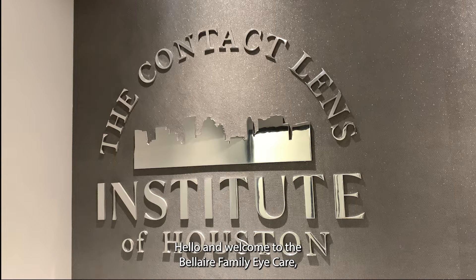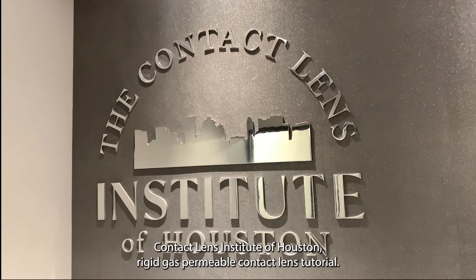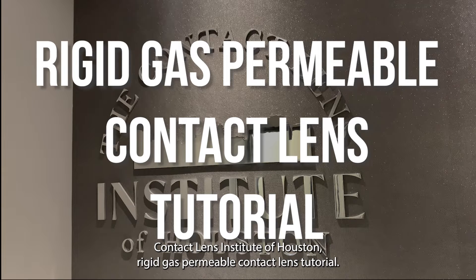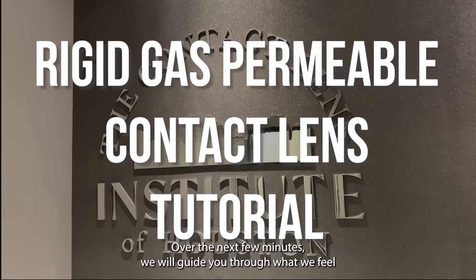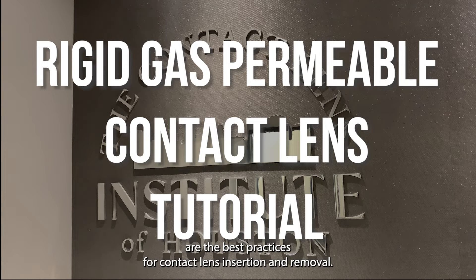Hello and welcome to the Bel Air Family Eye Care Contact Lens Institute of Houston rigid gas permeable contact lens tutorial. Over the next few minutes we will guide you through what we feel are the best practices for contact lens insertion and removal.